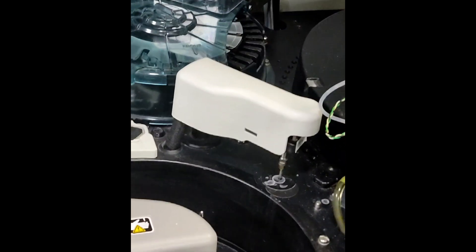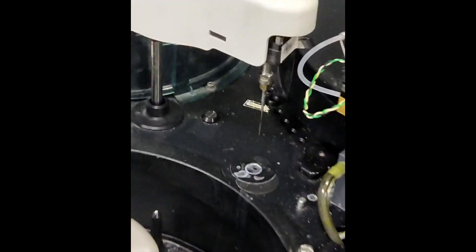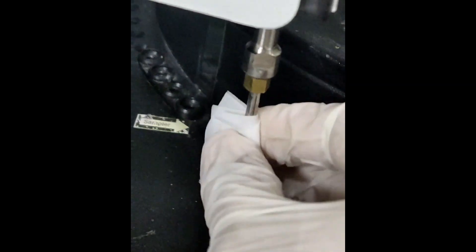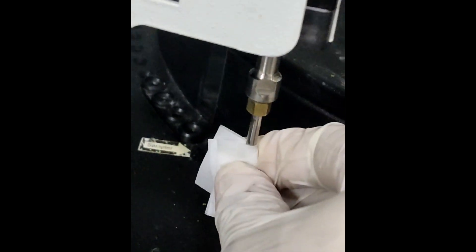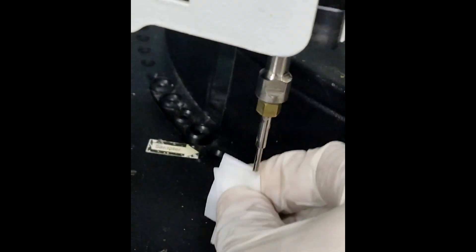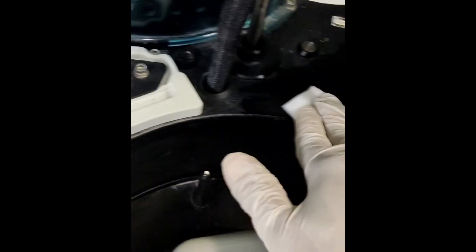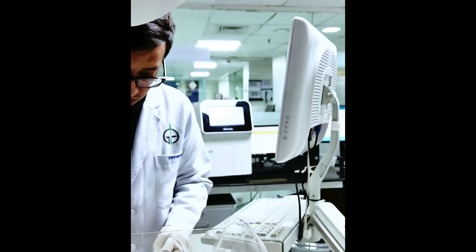After that, the sample probe will lift upward. We will clean its exterior with an alcohol swab in a downward motion. At the same time, we will also clean the sample processing region and sample holder tray.